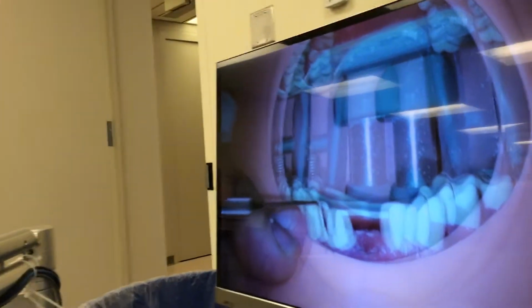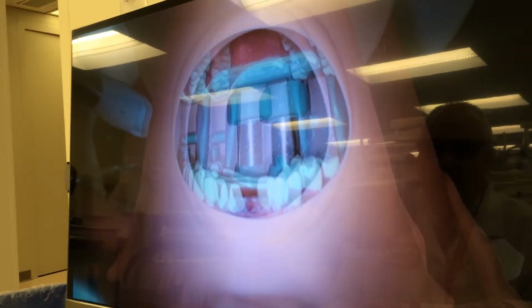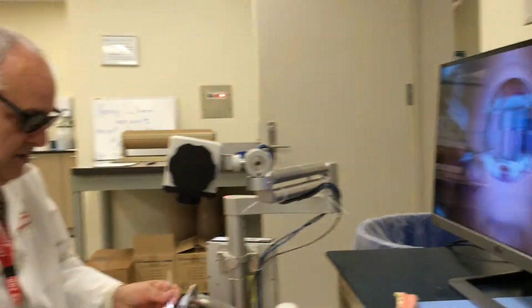You're looking more down one single tooth, where I want to get a view of the occlusal arch. Well, the other thing that this gives you is with your eye contact with the screen, you can come in with your instrument as you're zooming in, so you can see your instrument on the screen when it is, zoom out please. Here. Yeah, even a little more out, so as you're coming in, you can start seeing your instrument, you have eye contact with your screen, as you're coming in, and then you go in.